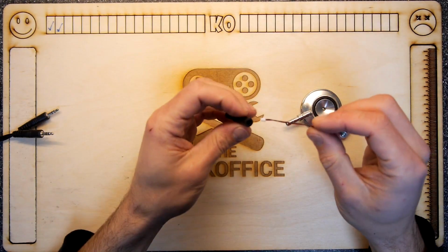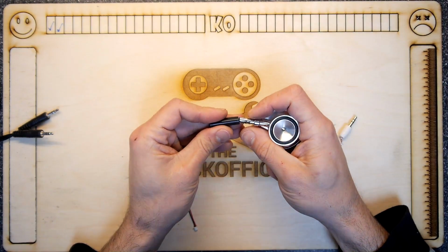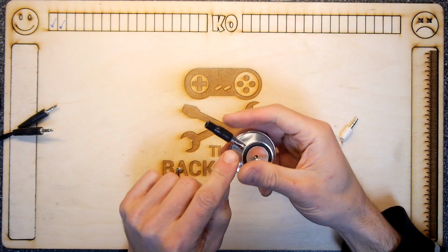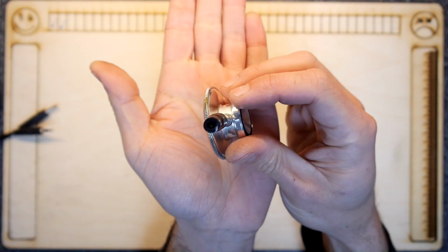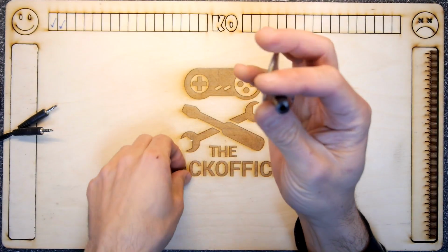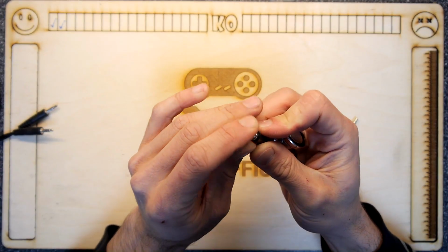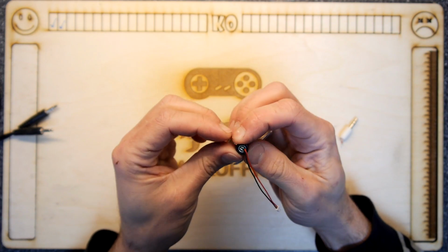I mean, as I was saying that, I thought of a way of revising my design, but let's roll with my original design in my head. It's a problem, you see, you're trying to optimize a design before you've even built the first one. So you end up with that and this open end. And just for full disclosure, this is the first time I'm building this myself, so if I go wrong, then you'll go wrong. However, watch it right through to the end and then you'll see if I manage to succeed or not.